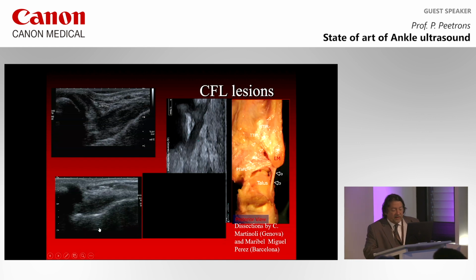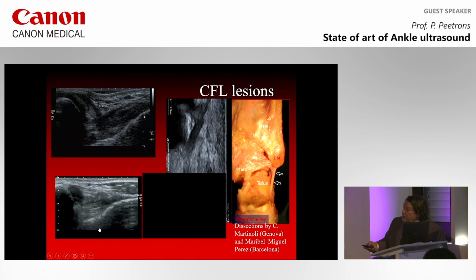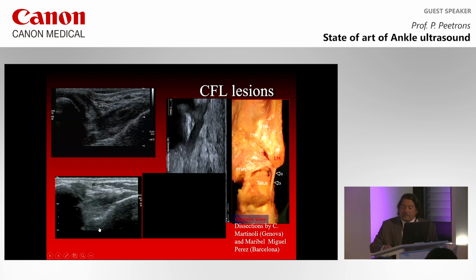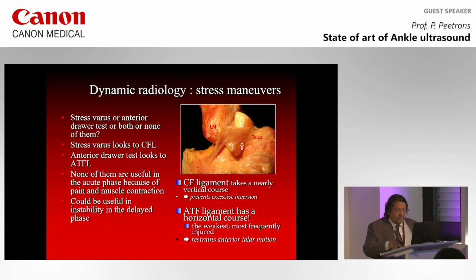In the opposite, an abnormal ligament will not show tension when you do the hyperextension. So the dorsal flexion, this is hyperextension. With the dorsal flexion of the foot, you can see that the ligament will not move and will not push the peroneal tendons towards the probe. The peroneal tendons stay there. This is a very good image of an abnormal CFL lesion.